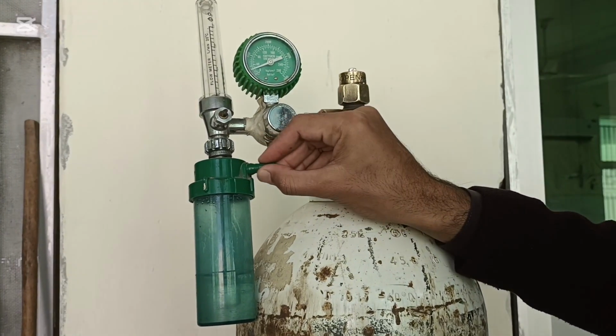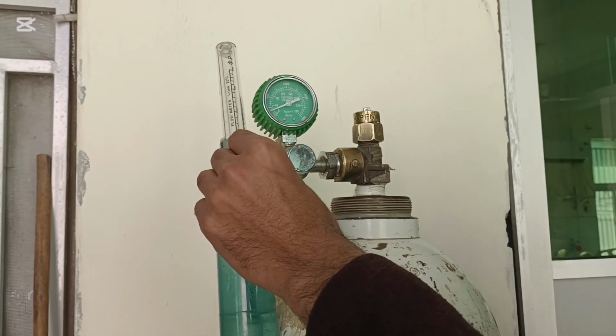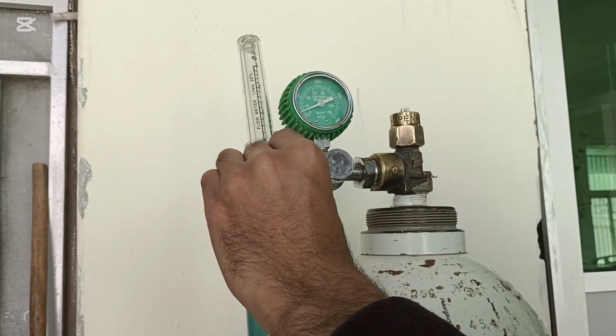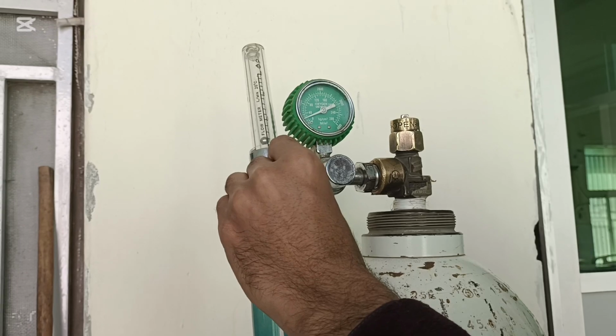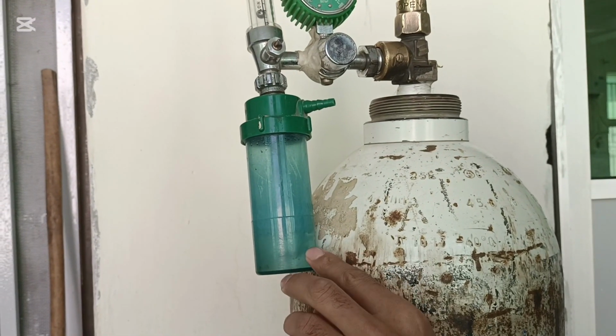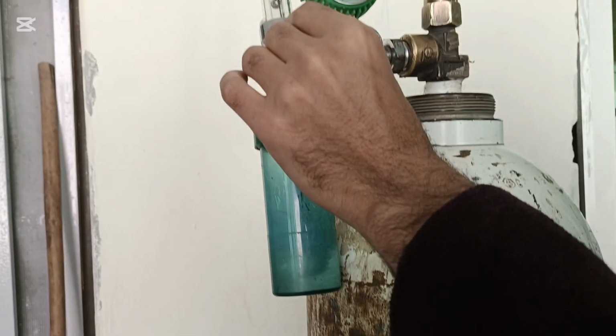When you insert the face mask tube into the outlet, turn the control valve anti-clockwise. The oxygen flow will start. You can see over here there are bubbles forming in the humidifier.